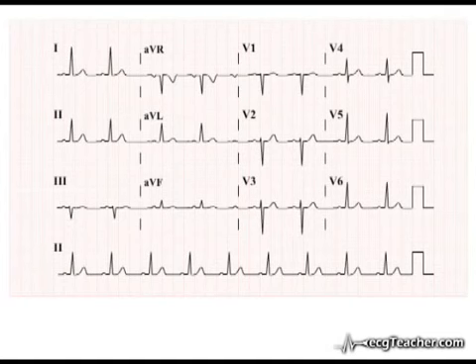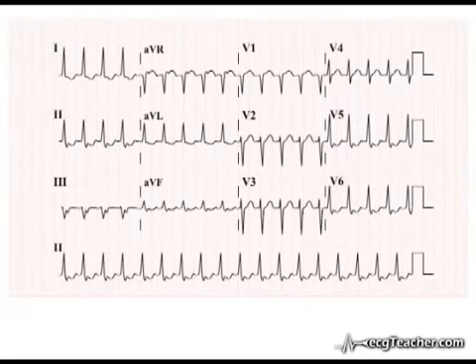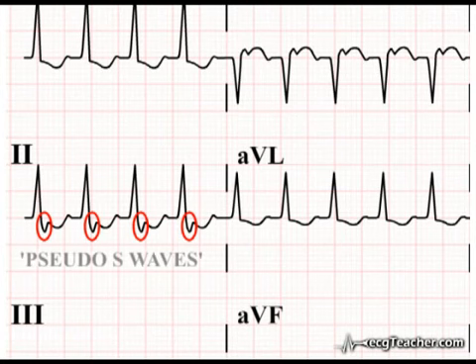In addition, the doctor noted on both the 12-lead ECG obtained during the attack and on the patient's monitor the presence of small slurred S waves in lead 2. In fact, these are pseudo S waves and represent P wave activity as atrial depolarization is spreading upwards from the junctional region and is occurring after ventricular depolarization.